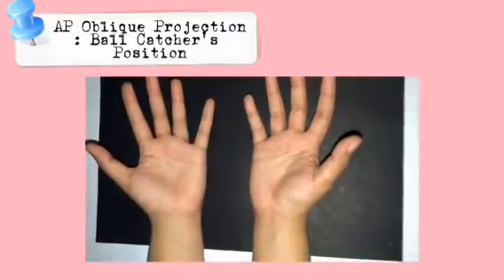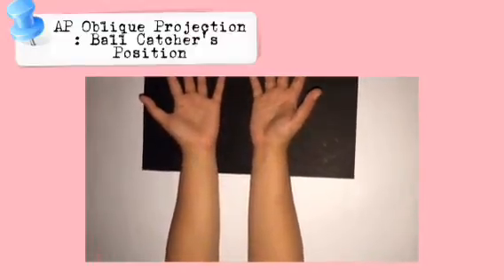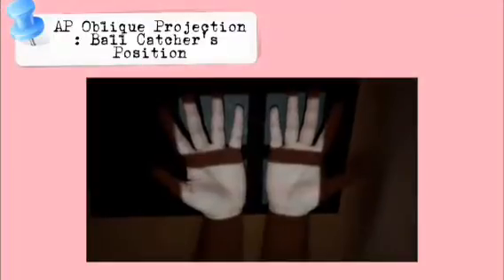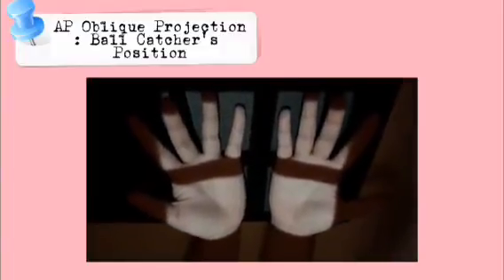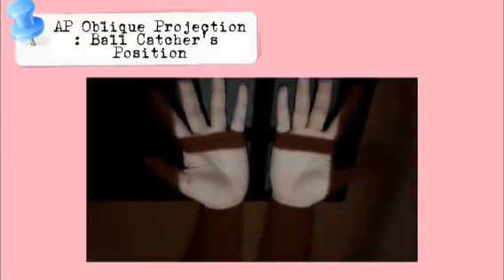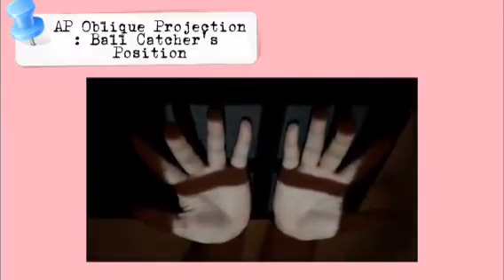The original method of positioning the hands is often modified. The patient is positioned similar to the method described except that the fingers are not extended. Instead, the fingers are cupped as if the patient were going to catch a ball. Comparable diagnostic information is demonstrated using either position. The central ray is perpendicular to a point midway between both hands at the level of the MCP joints for either of the two patient positions.